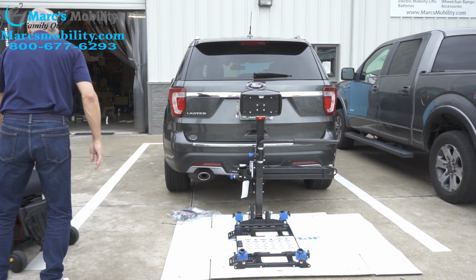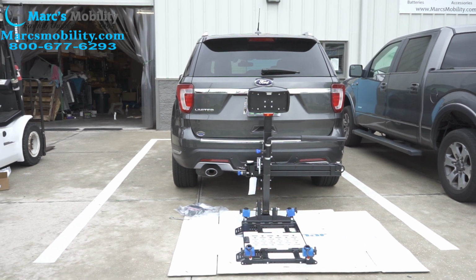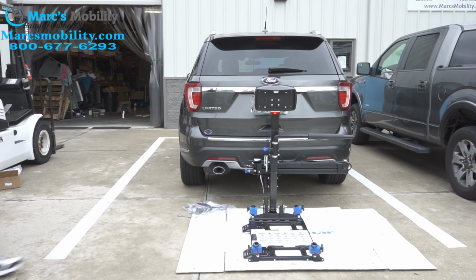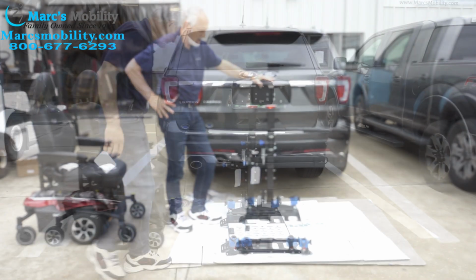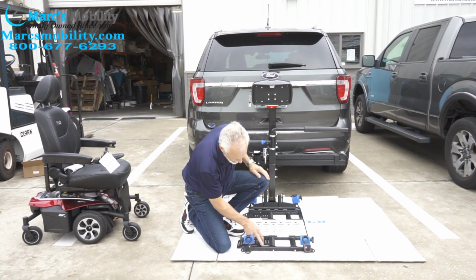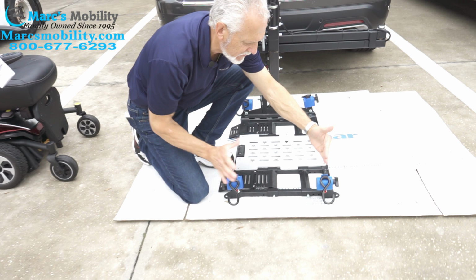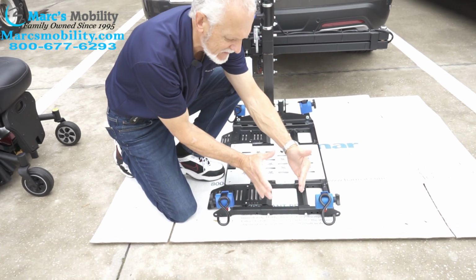Now, as I said, this lift will work. This lift will also work for smaller power chairs. All right, so if you're going to put a smaller chair on here, the tracks right here have to be moved. The tracks, this track and this track have to be moved. They're close all the way to the last holes.